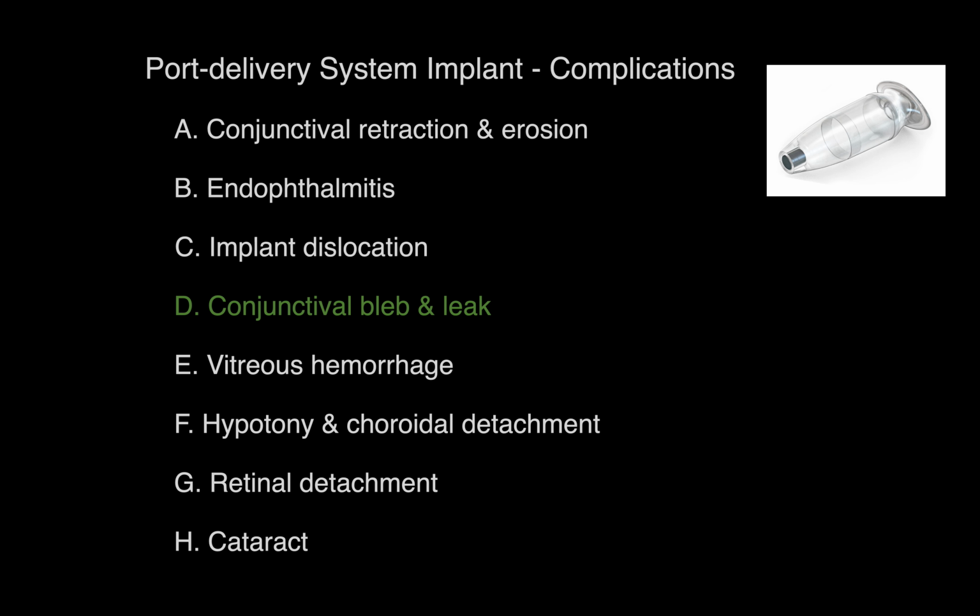The PDS implant and implant insertion procedure has been associated with conjunctival bleb, which is an encapsulated elevation of the conjunctiva above the implant.